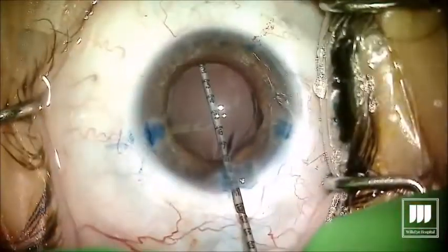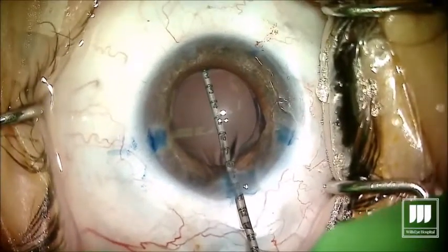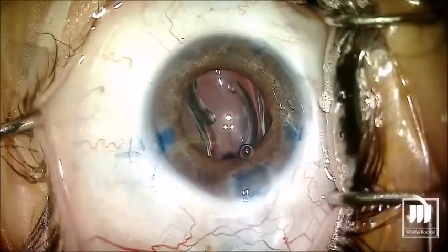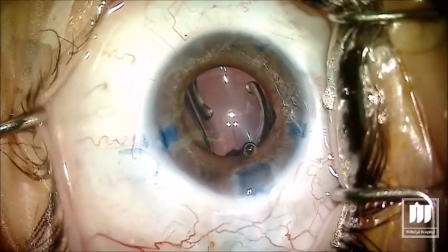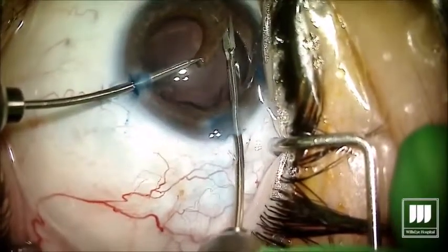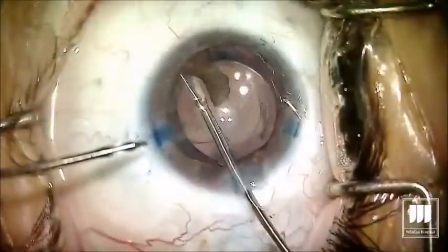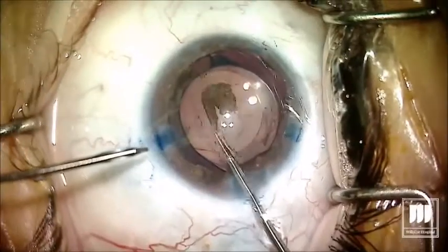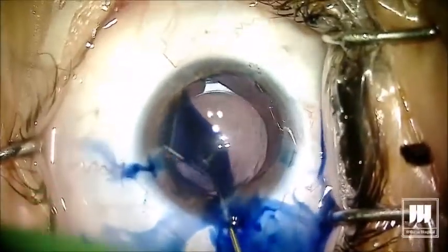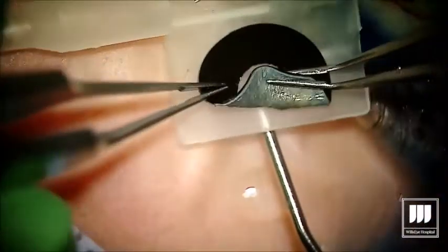A capsular tension ring is really a requirement for all these cases — that ring is to make sure the capsule is on stretch and to try to prevent phimosis down the road. If the capsule wrinkles, it's going to wrinkle up our prosthesis. But we actually don't see a lot of phimosis because the silicone prosthesis prevents the anterior and posterior leaflets from fusing.